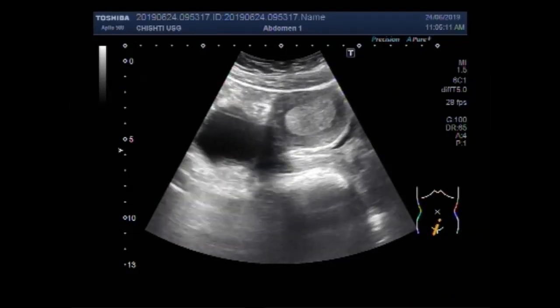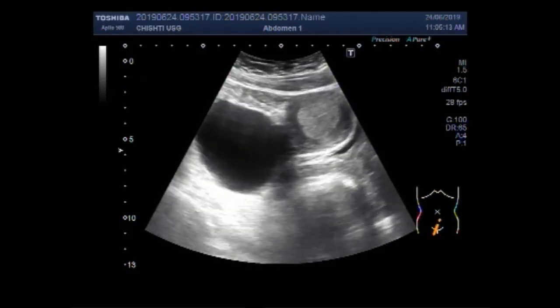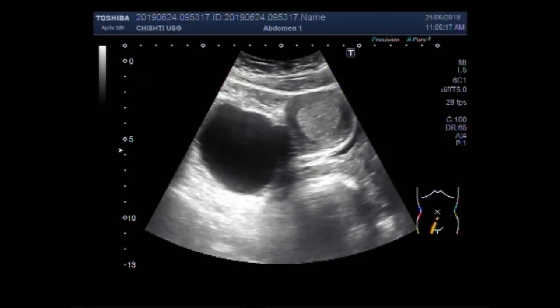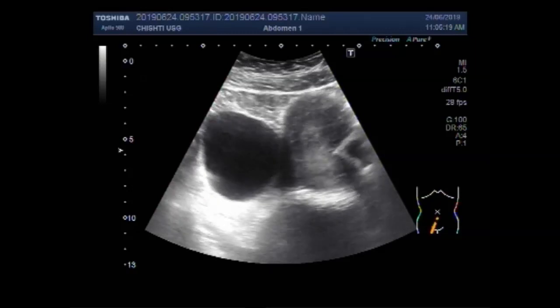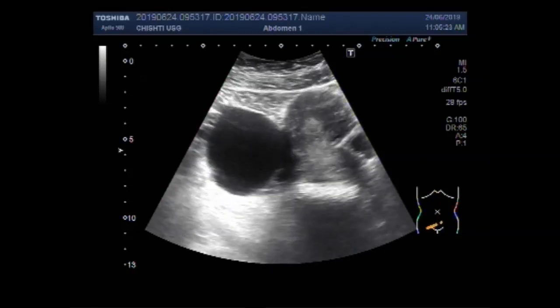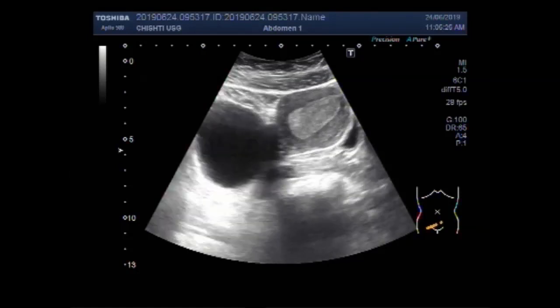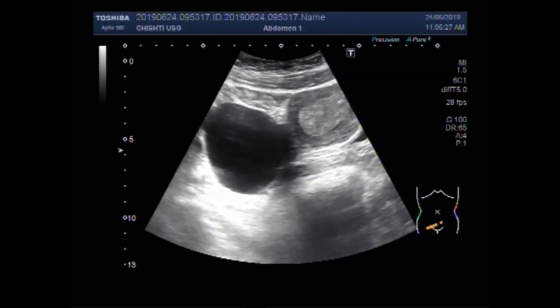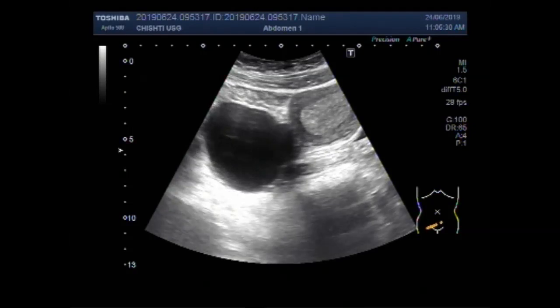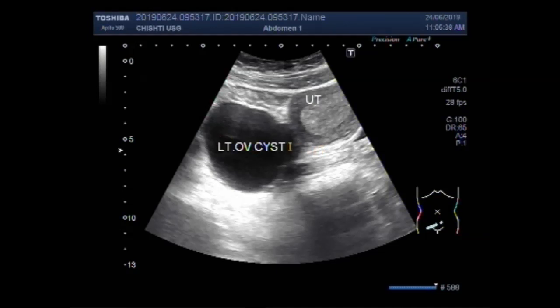Now you can see a large left ovarian cyst. The cyst is round to oval in shape and has clear fluid in its interior. This is the uterus and this is the left ovarian cyst.